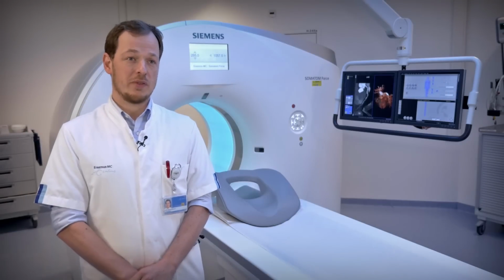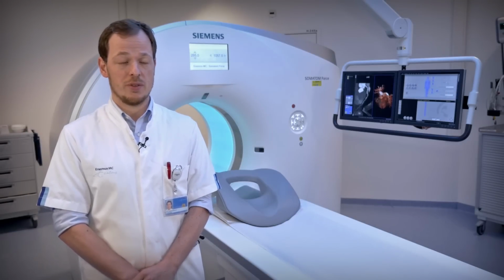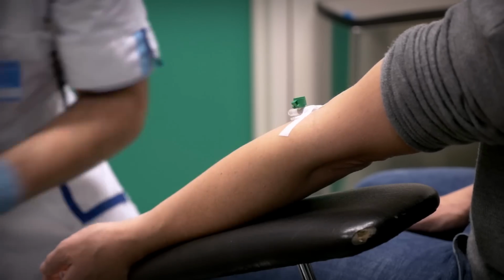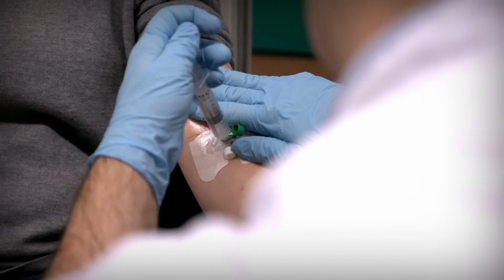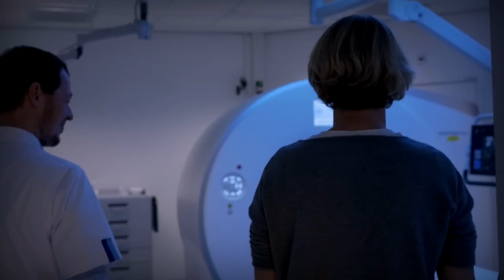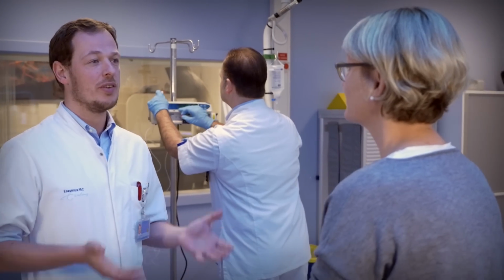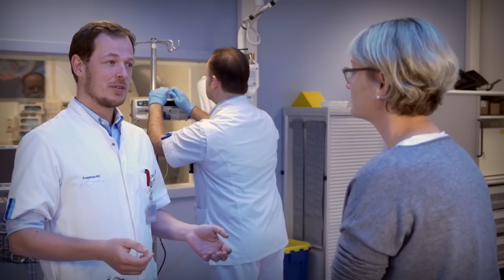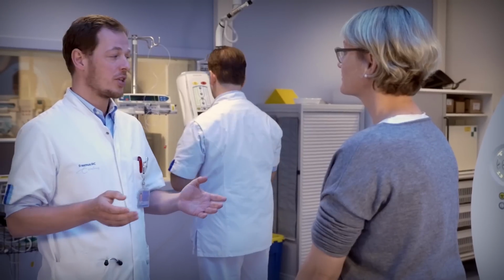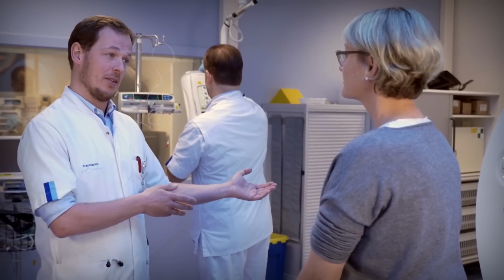For dynamic myocardial perfusion imaging, patient preparation is essential. The better the patient cooperates, the better the scan results will be. Before the scan, we explain the procedure and the sensations the patient will experience in detail. This will avoid any surprises during the examination. For the adenosine to work properly, we ask the patient not to drink any coffee or other caffeine-containing substances. Before the scan, we will practice the 30 seconds breath hold and go through the commands that she will hear during the scan, like breathing in, breathing out, and hold your breath.